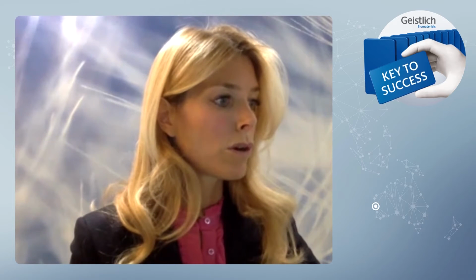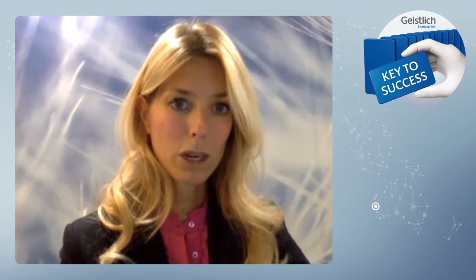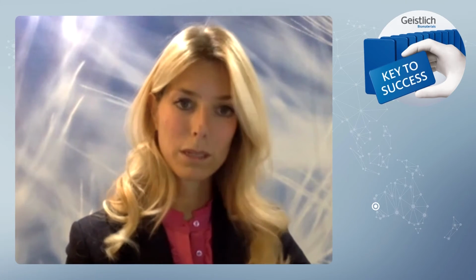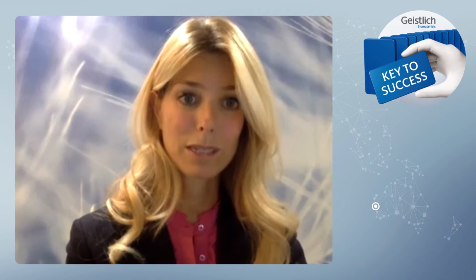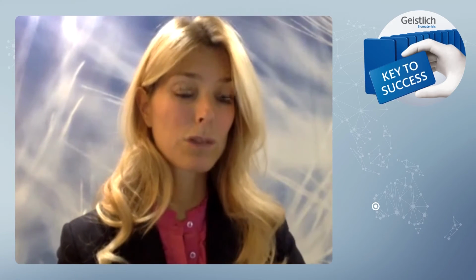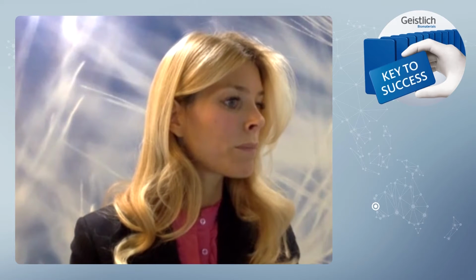What is the management for vertical releasing incision in the highly aesthetic areas? Have you seen a need for scar revision? Absolutely not. If the incision is performed correctly, then there are almost never scars. I tend to release vertically distally to the canines. This is for obvious reasons. So I am not scared of elevating a larger flap when everything is maintained and there is no disease, of course, which implies that you're doing GBR. So definitely distal to the canines if you have to do it.